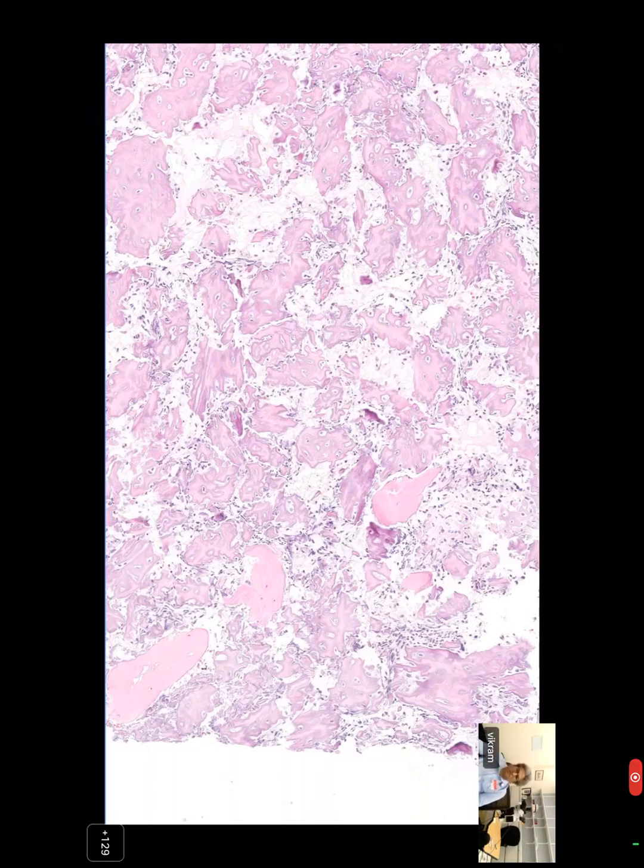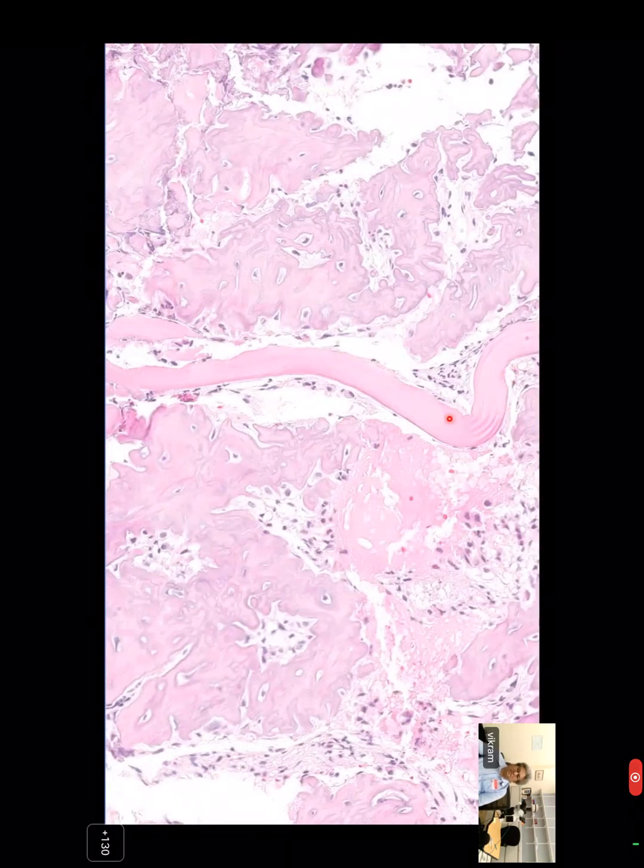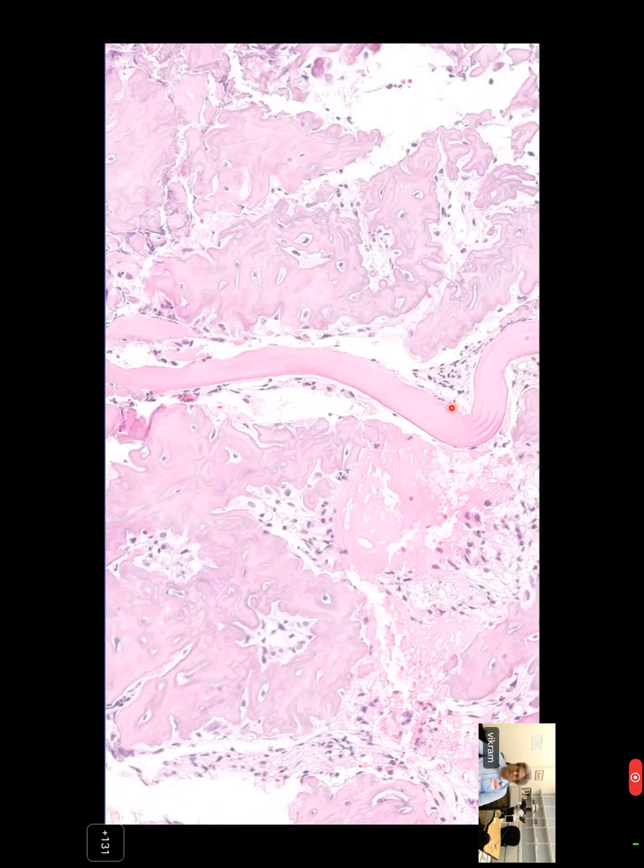So it's a beautiful case of a very sclerotic osteosarcoma. Here you see it again. So this is lamellar bone, see that in the center? You can see these beautiful lamellae. If I could crank the condenser down, it would be much more prominent. But fortunately, a histology artifact has made it rather prominent for you. And then you can see tumor on both sides of that. But you can again see how incredibly bland it is. So these are all osteosarcoma cells, but when they've got trapped in that bone, they've gotten normalized.